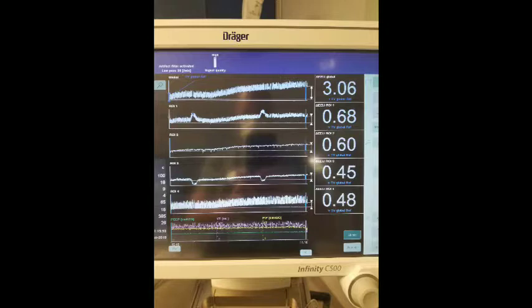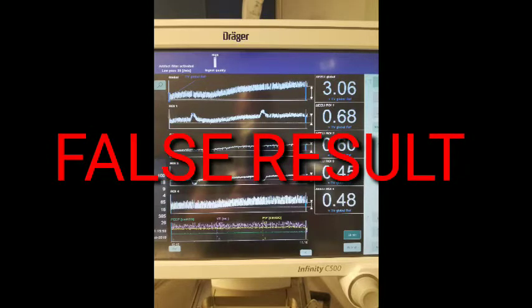They do have to go through the tissue, the adipose tissue around the chest, etc. That third spacing, that edema that somebody 3.5 liters positive would have, obviously you're taking all of that out. The tomography is only interpreting an image based on these impedances. Therefore, this is a false indication that the patient is recruiting.